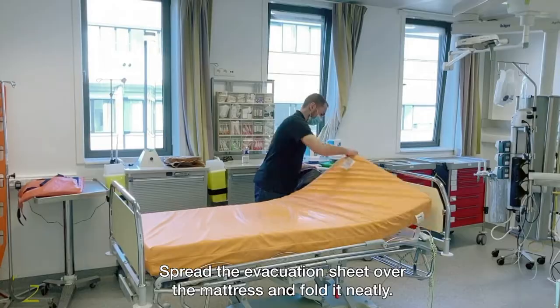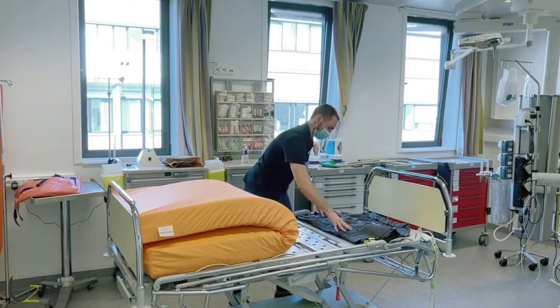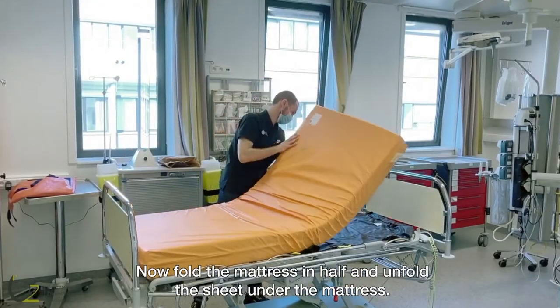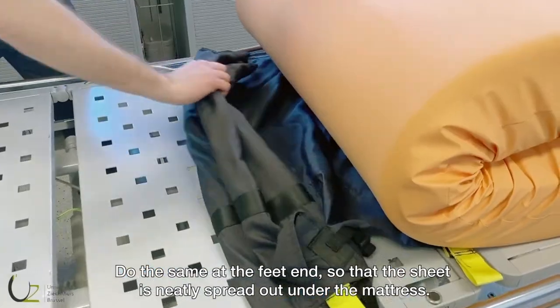Spread the evacuation sheet over the mattress and fold it neatly. Make sure the label is facing upwards and visible. Now fold the mattress in half and unfold the sheet under the mattress. This is the ergonomic way. Do the same at the feet end so that the sheet is neatly spread out under the mattress.